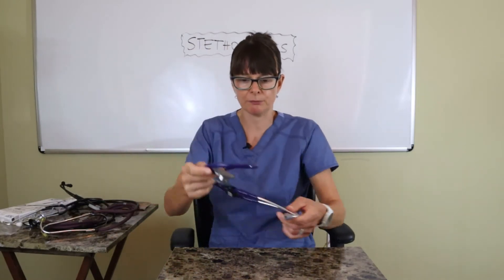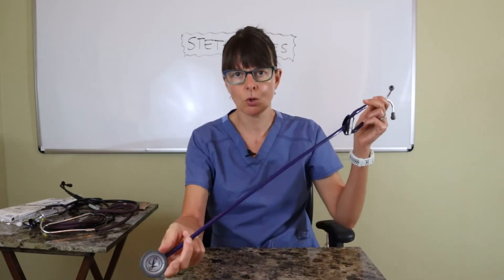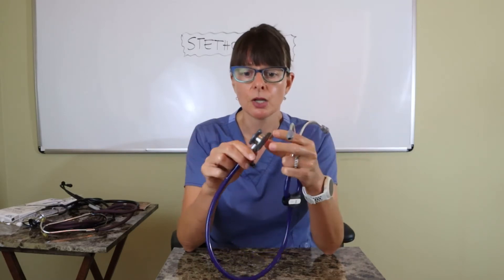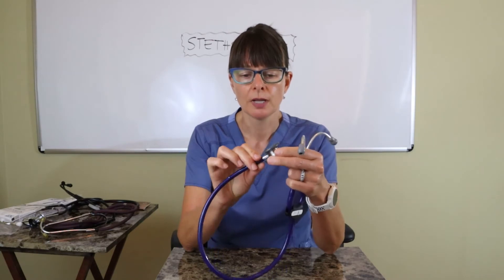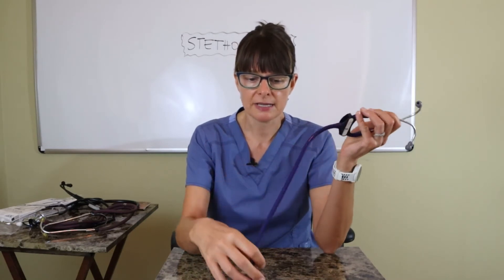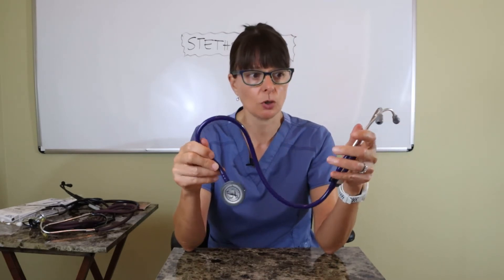Over here — and I have to say I'm pretty biased, having only used Littmann stethoscopes in my entire nursing career — this is the one I've had for probably 15 years. This is a very typical Littmann reversible stethoscope called the Classic II. You can reverse from the bell to the diaphragm. It comes with softer earpieces, has flexible tubing, and is pretty lightweight — it's a really good quality stethoscope.